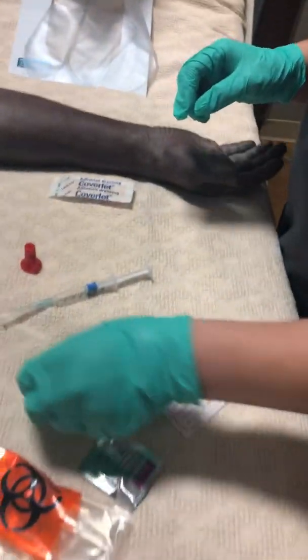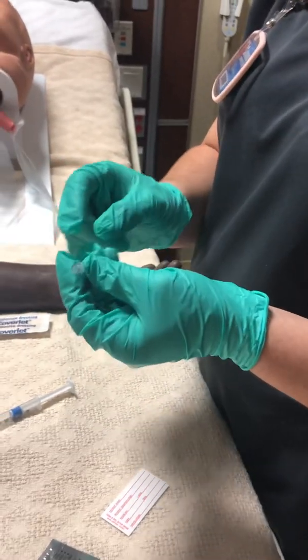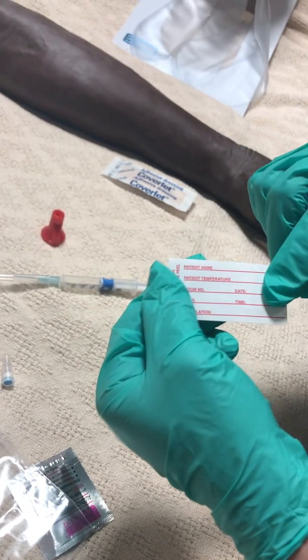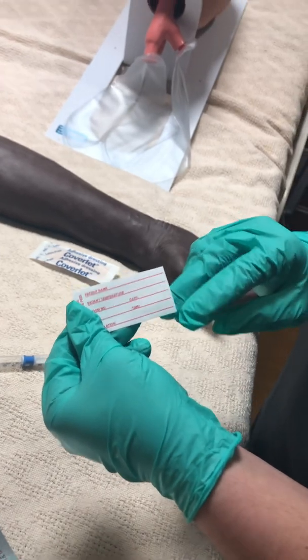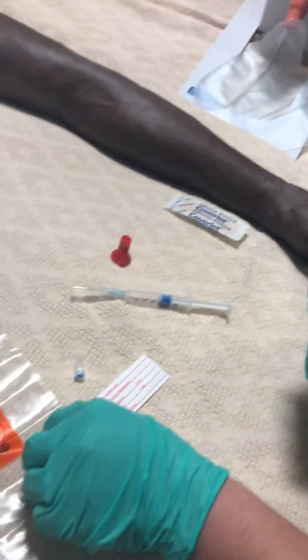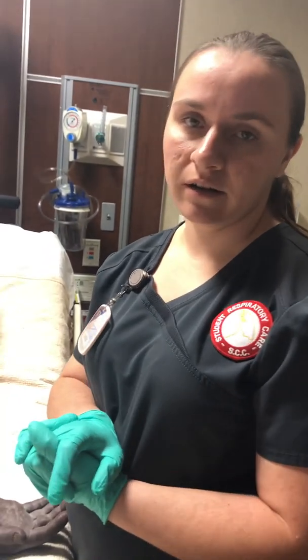When I am done, I always need to place the stopper on and make sure there are no clots in the needle. I place it into my biohazard bag. Then I write on my label the patient's name, the temperature, room number, date, the test that I did, and the time I did the test. If they're on oxygen or room air, I write down the FiO2. If they're on room air, the FiO2 is 21%. If I can't get the blood sample to the lab in a timely manner, so that it won't clot, I need to put it on ice.